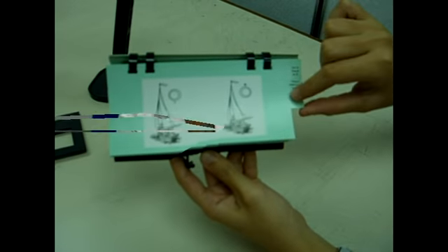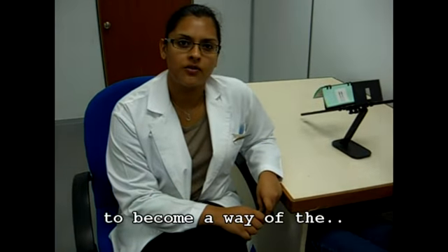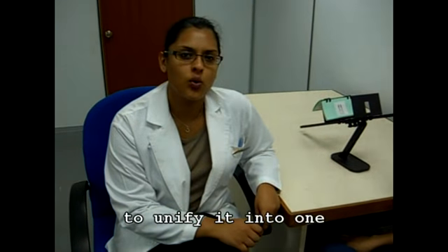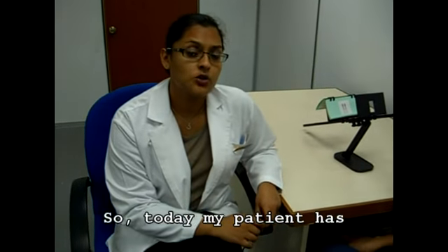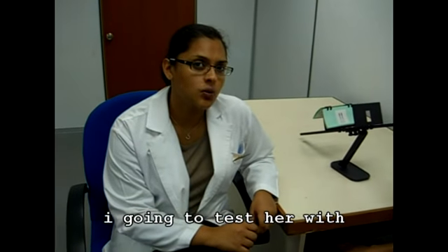Our first goal in this therapy is to become aware of the information from both eyes and to unify it into one visual percept. So today my patient has convergence insufficiency and I'm going to test her with the single aperture.